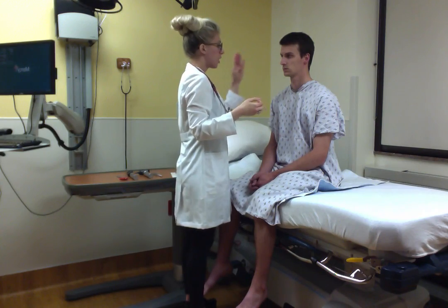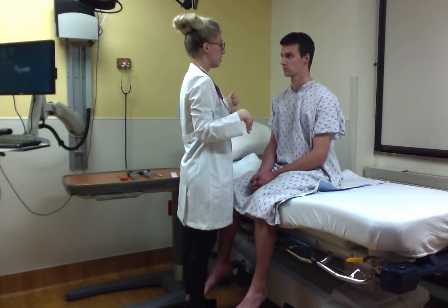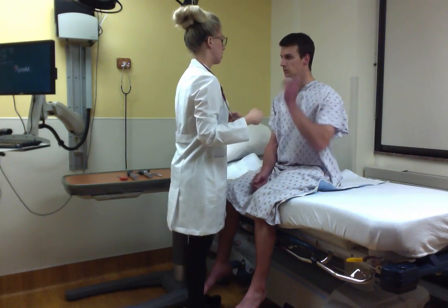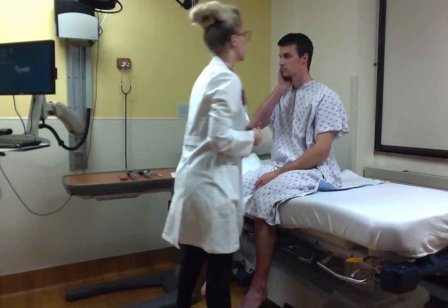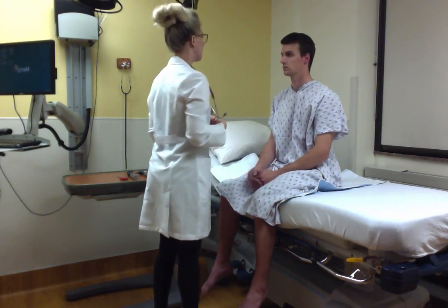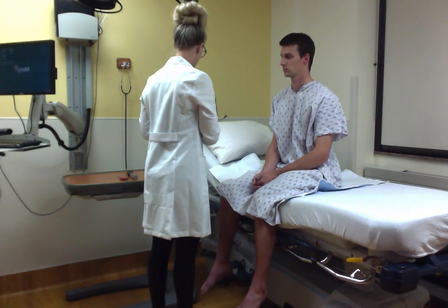And now I'm going to have you cover one ear at a time, and I'm going to whisper a word, and we're going to perform the whisper test, and I'm going to have you repeat the word. So let's start with this side. Cat. Good. Purple. Good. Okay. Now I'm going to just go ahead and inspect your ear canal.